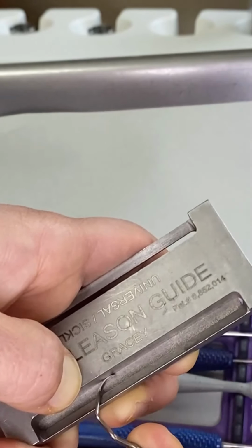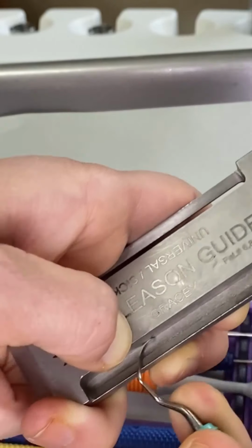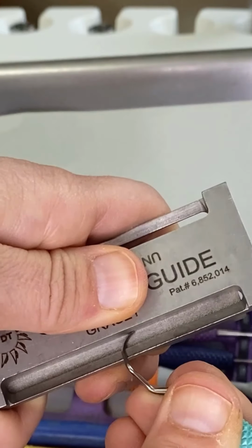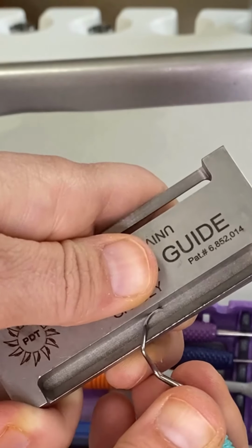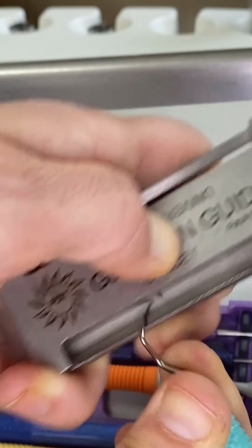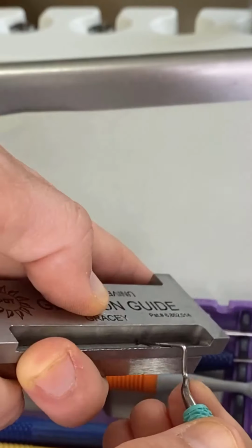Because the Gracey has a shorter cutting edge, I don't really do much of a pendulum swing, but I do a little bit of it. And I really don't have any issue with my toe becoming too sharp. But if you do, I think it's probably because you're too far forward. And if you're not getting it sharp enough, it's because you're too far back. So you just have to find that middle ground so the back of that cutting edge is against the wall. And then you'll see that flexion, making hygiene instructors mad all over the world.